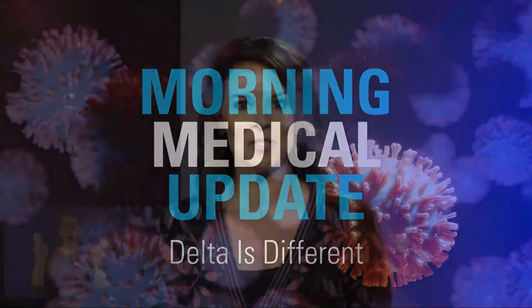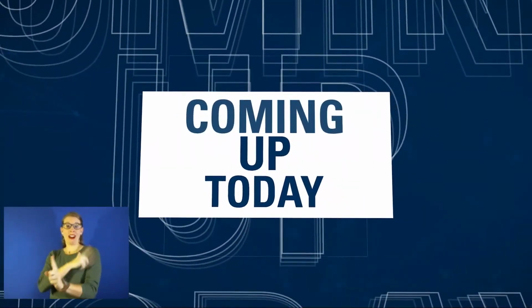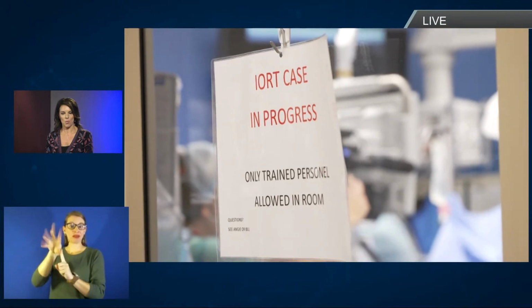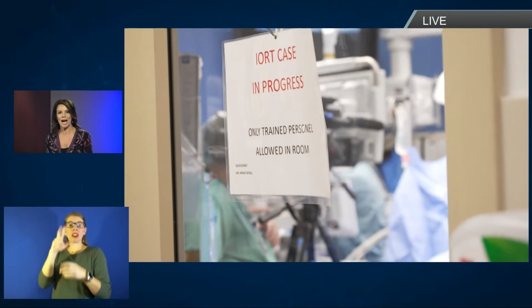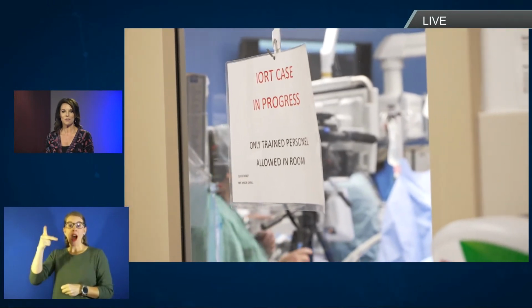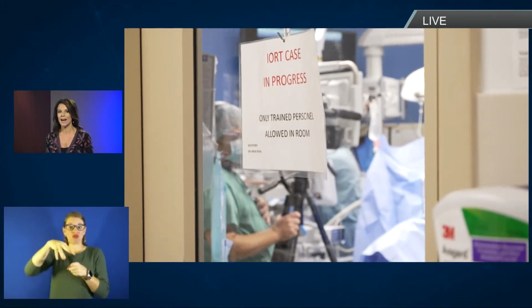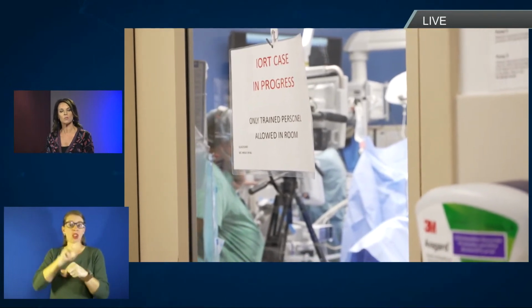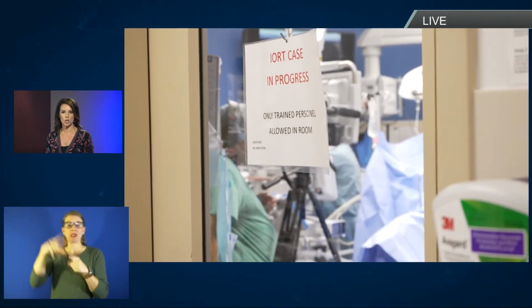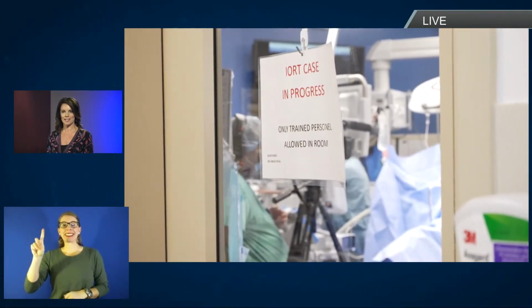We are live inside the Dolph Simons Jr. Family Broadcast Studio. Today we are taking you inside the scenes of our hospital. You are looking live just outside an operating room where the 100th patient to receive intra-operative radiation therapy, also called IORT, is happening this very minute. This radiation therapy is FDA approved for breast cancer patients who catch their cancer early. It allows them to have the cancer removed and then treated with radiation in a single dose, all in the same procedure. Alexis Del Cid and crew have been documenting this case since early this morning.